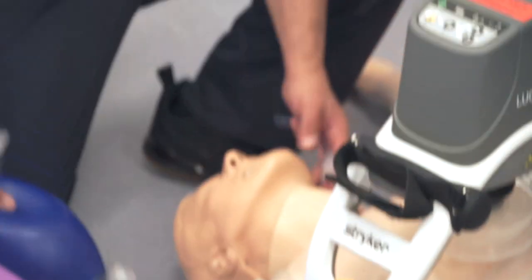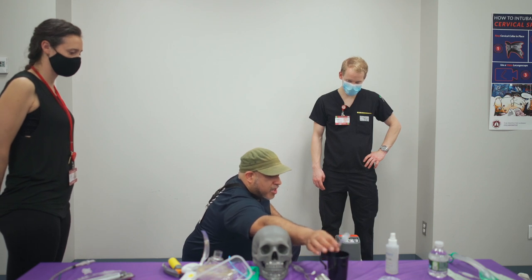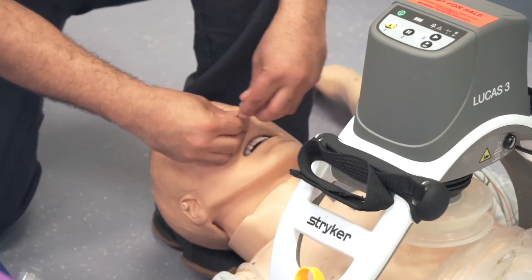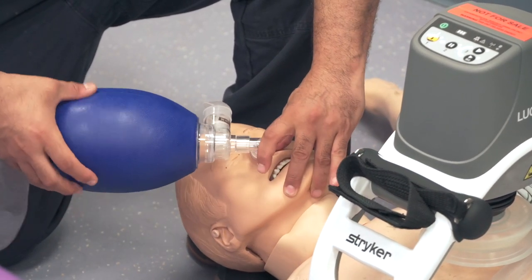So for this mannequin, I'm going to lube this. Naturally, it'd be lubrication, not blood or saliva, but go through the nose, hub it, and then I would cover the other nostril and aerate. There's even a cooler scenario that I don't have, a helmeted patient whose jaw I can't access, but the nose is open, and I can oxygenate this patient and keep him alive. Otherwise, ask for help, or find my scalpel and do a surgical airway.